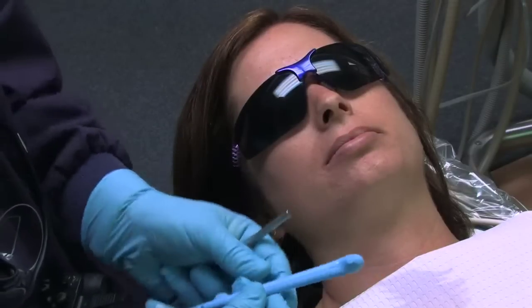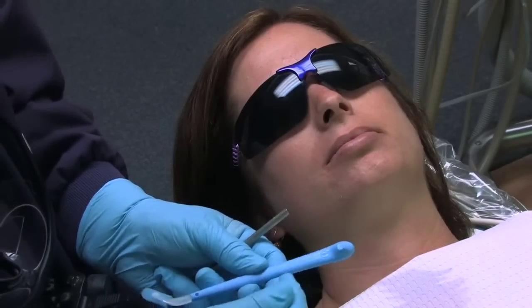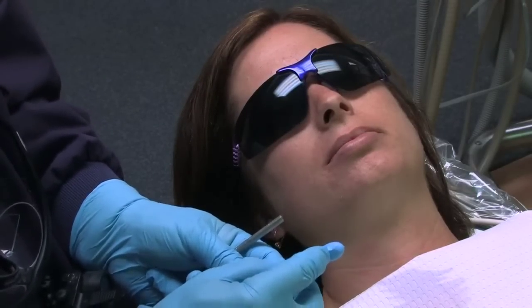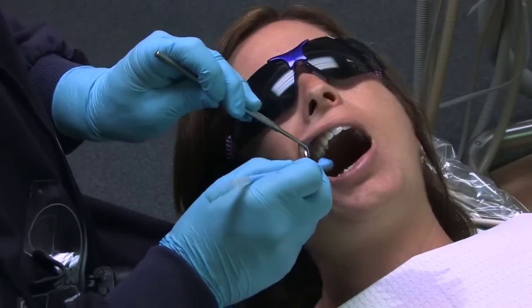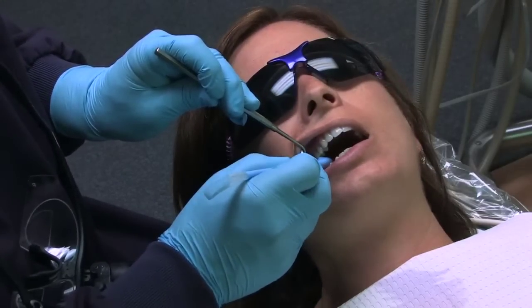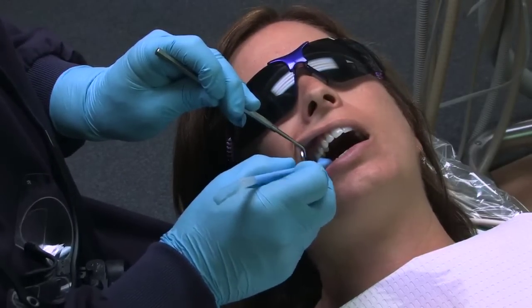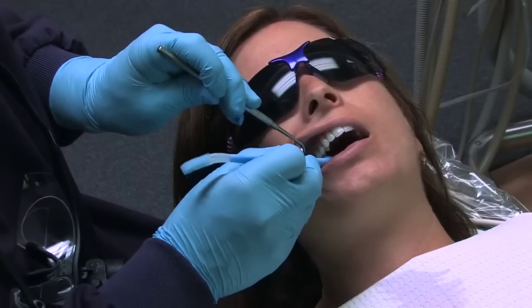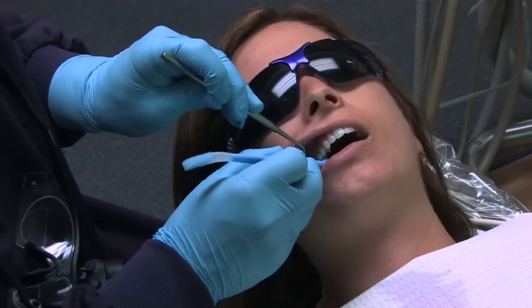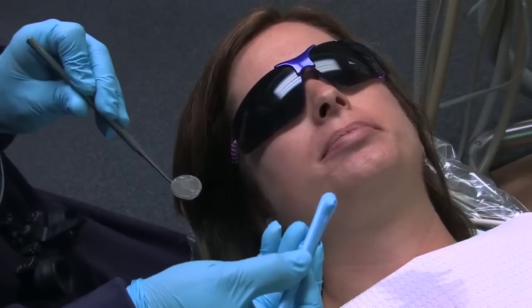The EDX is a dual purpose instrument. On the opposite end of the handle is a pyramid shaped structure that can be used to test for fractures in teeth. The frac tester can be placed onto a tooth cusp and the patient bites down onto it with a rocking motion. If there is a crack or fracture within the tooth, often the patient will respond with a positive reaction which will indicate precisely where the fracture is located.